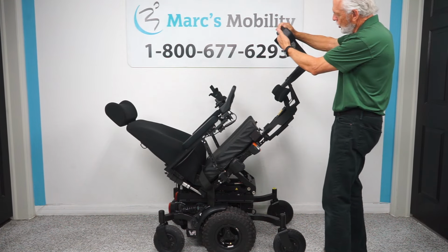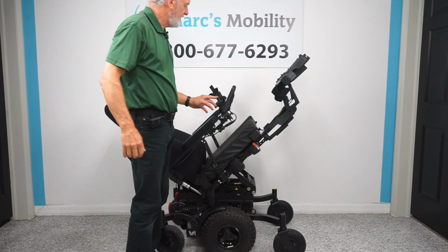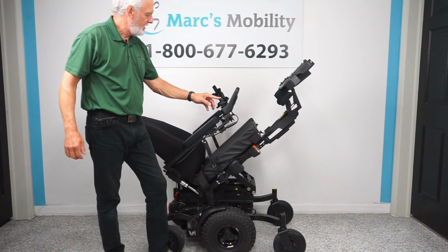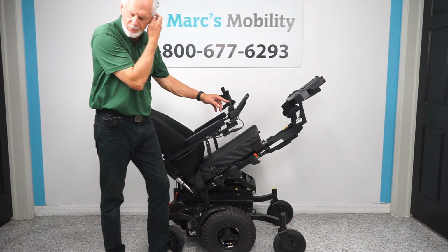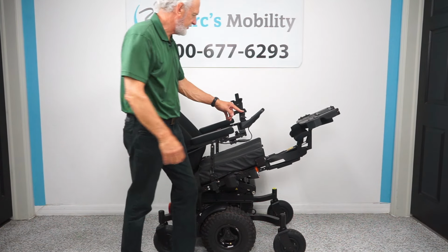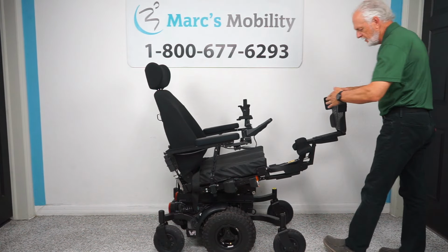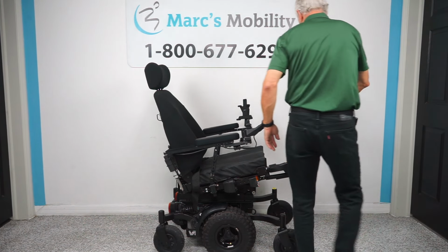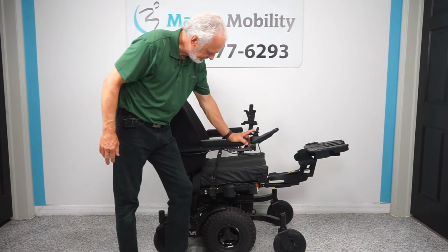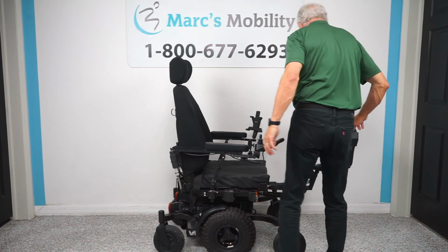And you also have guards on this foot plate that are added to the chair, which I'll cover in a few minutes. So let's bring the tilt back down, and I'm going to show you that when the tilt is down, you can still have your feet pretty high even though you're not tilted all the way. So even if you were here, on this model, look at your feet. They're still higher than your body. Okay? We'll bring the seat all the way back down. Leave the foot plate up.